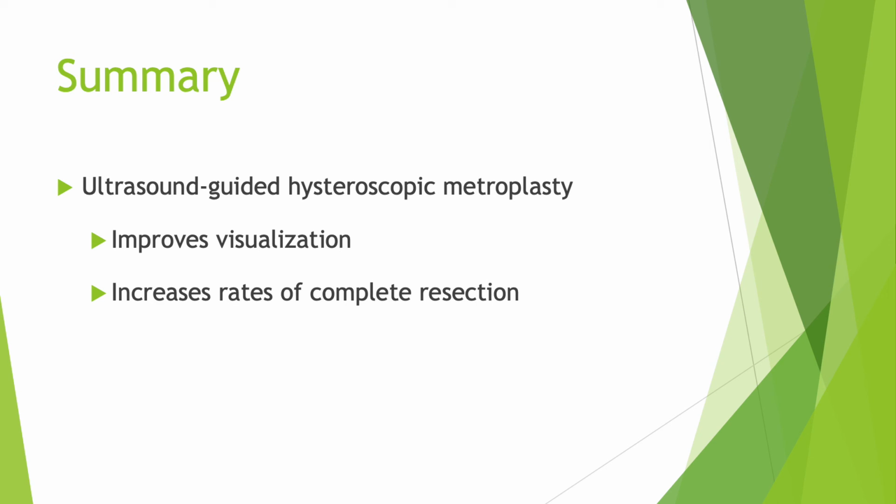Ultrasonography is a useful tool that can be added to hysteroscopic metroplasty. It improves visualization during resection of uterine septum and has been demonstrated to increase the rates of complete resection. We encourage you to make this small change that may lead to improvements in your clinical practice.